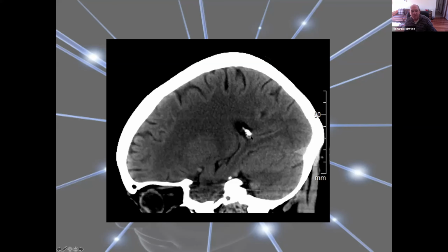The first girl was right in that it's a T1 because the fluid's dark, okay? If it was an MRI scan, it would be a T1. But if you have a look at it, you can see that the bone has absorbed the radiation, so the bone's bright, okay? And then of course you see the choroid plexus is bright. So those structures are calcified, they've absorbed radiation, so it's a CT scan. Okay, but that was me being particularly nasty.